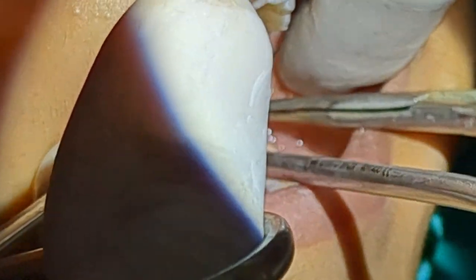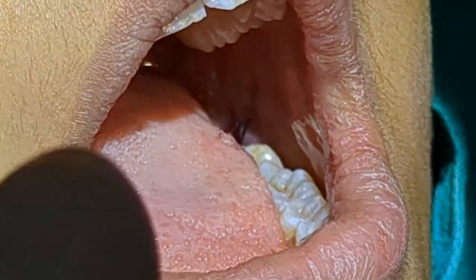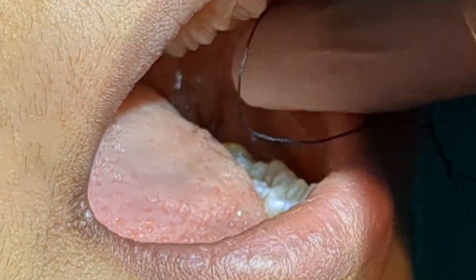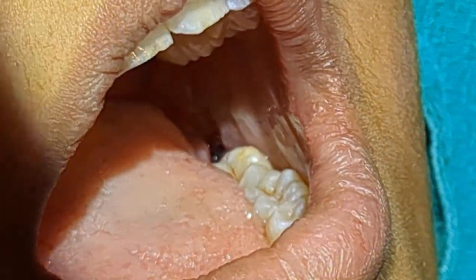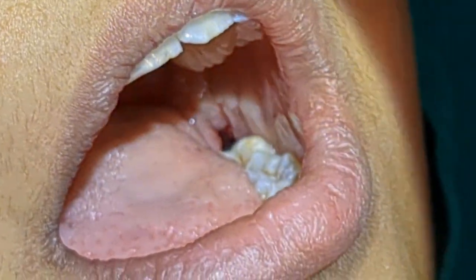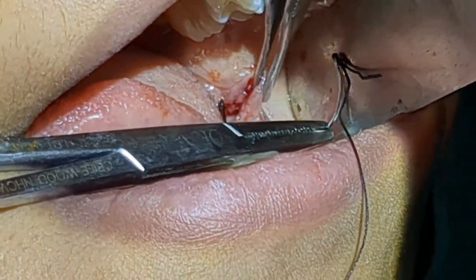I always keep the sutures that are distal to tooth seven a little longer so that it is easier to hold on to the knot — it should be easier to hold on to these and pull them out and cut them. And so again, distal suture.